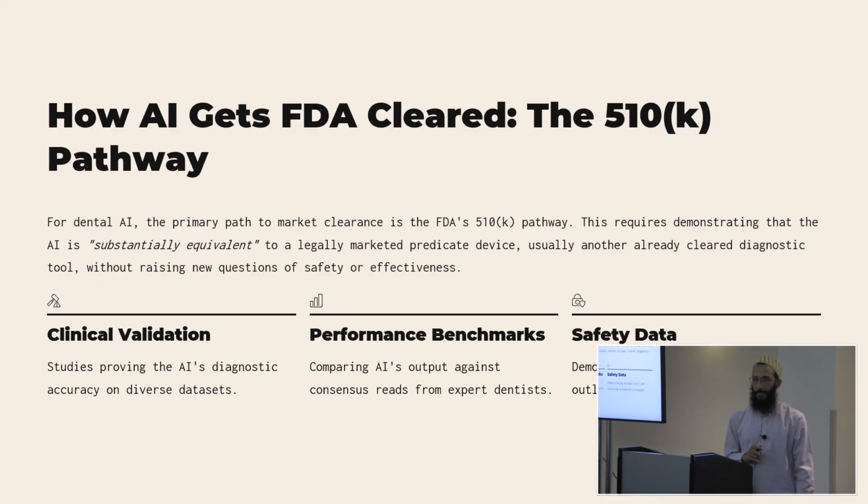So you mentioned that if it sees a lesion that's not part of the tool, it's out of scope. What about lesions that are not odontogenic or not tooth related? When I worked there, we didn't support lesions that weren't tooth related.